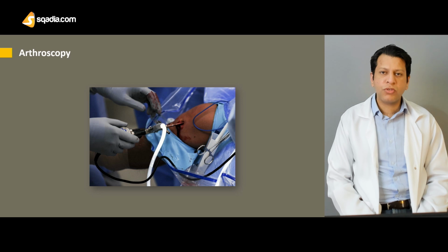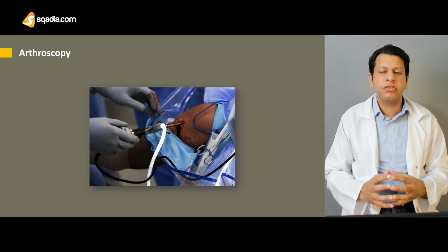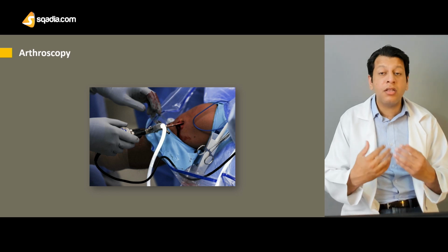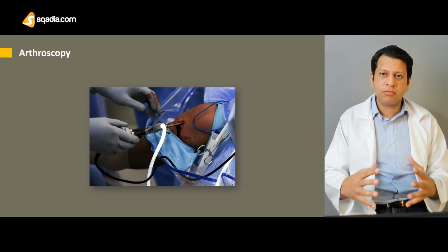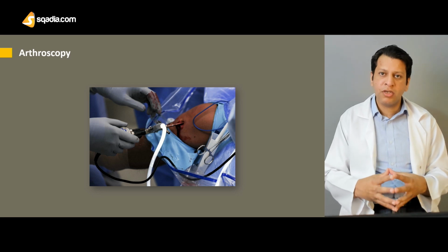So it was basically the same endoscope which was developed by Dr. Hans Christian in 1910, which was further modified into a cystoscope, a laparoscope, as well as a laparothoracoscope. But primarily what was being done there was mainly just for diagnostic purposes, or viewing the inside pathology.